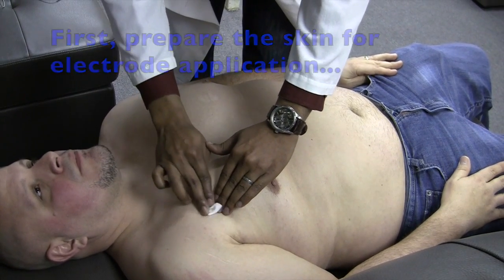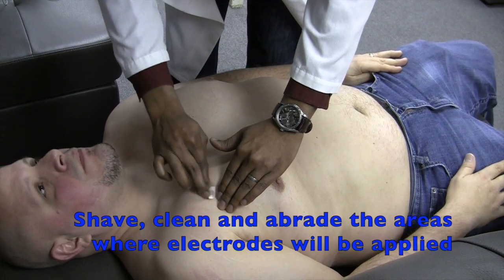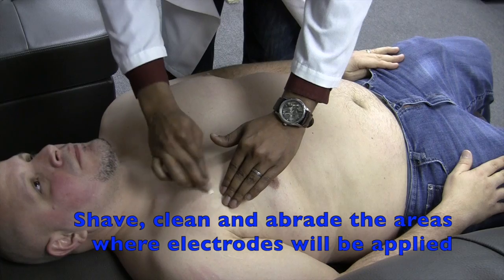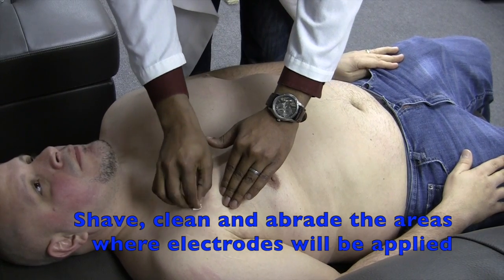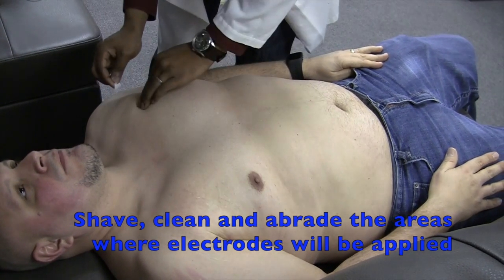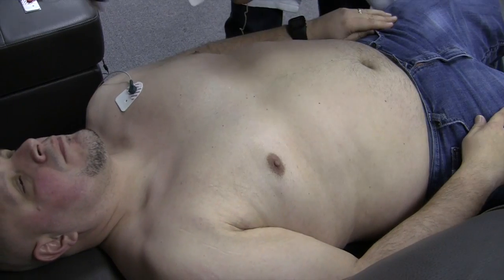First, prepare your subject for the ECG. Proper electrode placement is critical to ensuring you get reliable data.